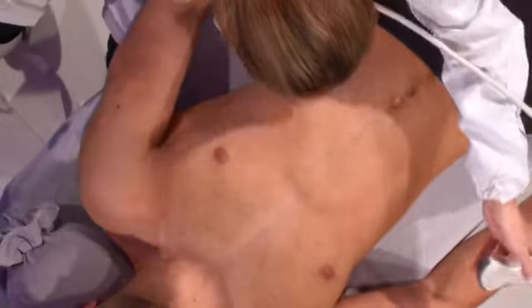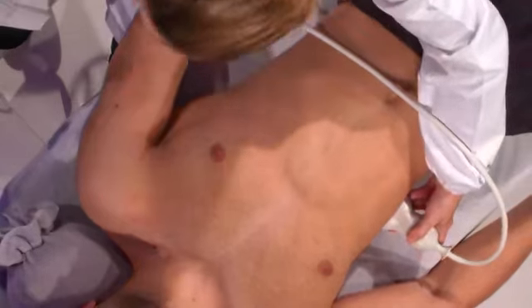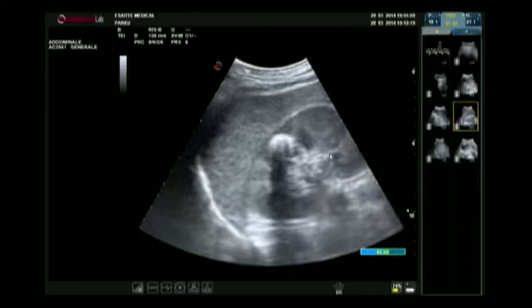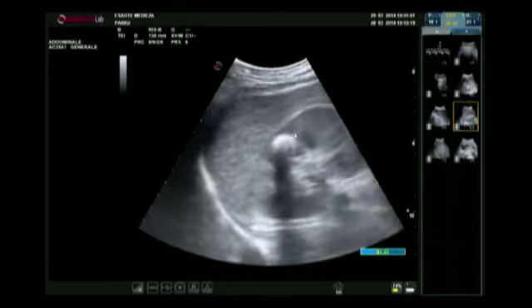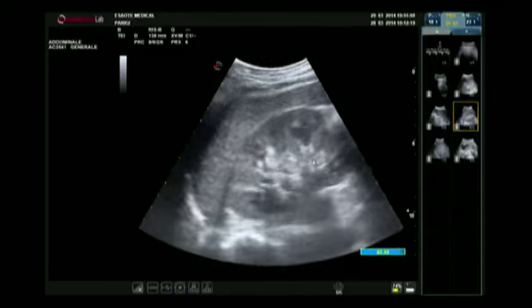If you have a patient with trauma, the FAST protocol is indicated, and you should scan the right upper quadrant, the upper abdominal quadrant, like this. And you can see this image, it's the perihepatic space, and you see the liver here and the kidney here. This is useful to exclude that you have a hemoperitoneum in your patient.